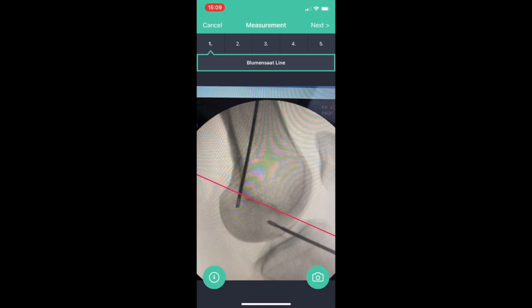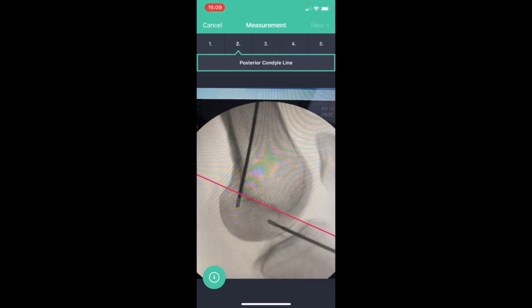By releasing the finger the line is tight. Then I move on to the next step. Here I have to define the posterior condyle line.